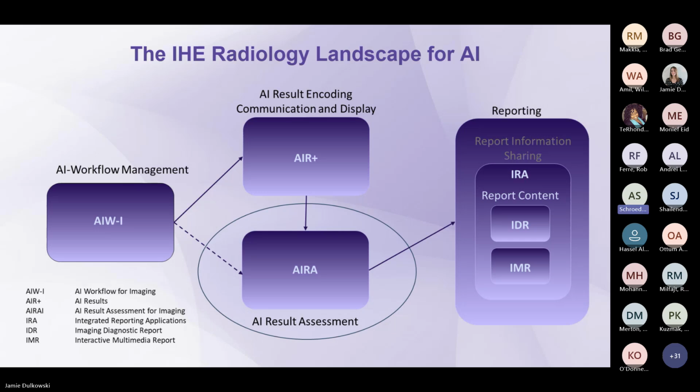IHE Radiology has already started developing an AI-related portfolio a while back. There is the AI workflow management, which is the overarching profile, which manages the AI workflows, assigns tasks, and so on. Based on that, there is the actual encoding of the AI results by an evidence creator. That creates AI objects of various types with various findings, which we obviously, before they go into the actual reporting process, want to do the assessment on, which is the scope of this profile.